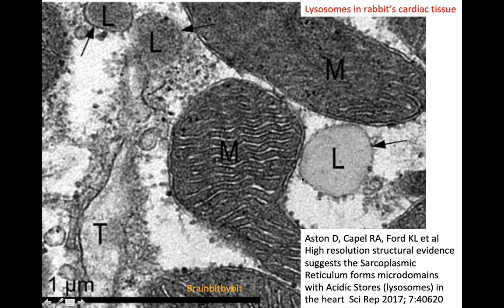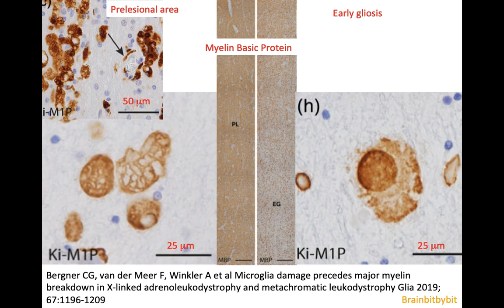The lysosomes in the microglial cells are membrane-bound organelles with a close relation with the mitochondria, and they accumulate all the sulfatides that cannot be degraded in metachromatic leukodystrophy. If you look at the different areas under the microscope, you have the pre-lesional area stained for myelin basic protein with a lot of myelin, and the early gliotic area, which is not nearly as brown, so there's a lot of myelin loss. Zooming in to the macrophages and microglial cells, you can see that in the pre-lesional area the macrophages already look different, and the microglial cells as well. You see all these vesicles, which are probably lysosomes with the sulfatides stored in them.